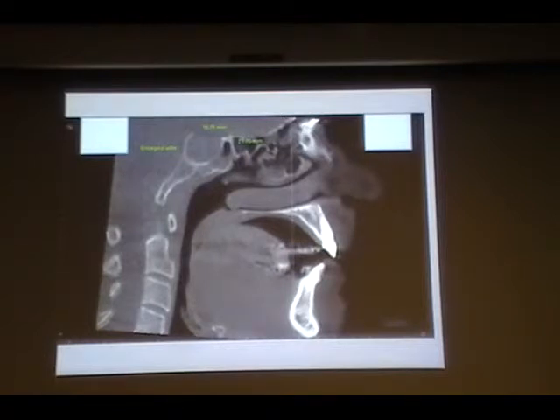This is the sphenoid sinus here. Part of it is filled with soft tissue. Part is air-filled. And there is a breach. If there is a pituitary adenoma, it is going to enlarge, and then it's going to take away the bone that is present below, and it has penetrated even into the sphenoid sinus.